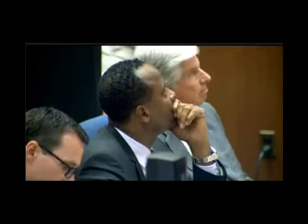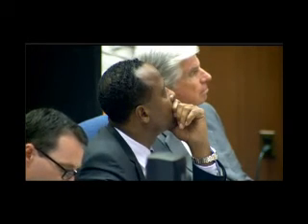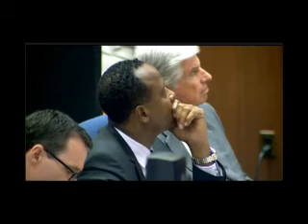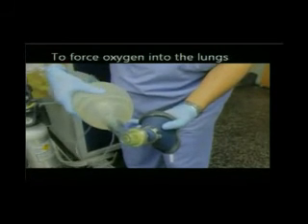The theme through all of this is uninterrupted supply of air and oxygen to the patient. That's what can never be compromised. And so you can see multiple approaches to the airway, multiple approaches to having oxygen available, and two different ways, the anesthesia circuit and the backup bag available in the operating room, so that you can force air into a patient who stops breathing. Please continue. And there he's verifying that he can force oxygen into the lungs with the resuscitation bag. Stop.